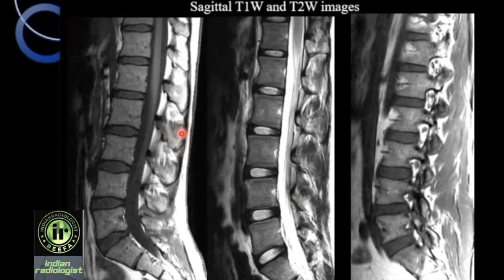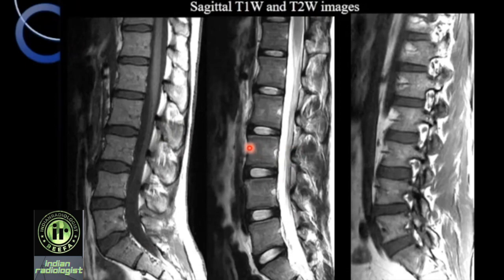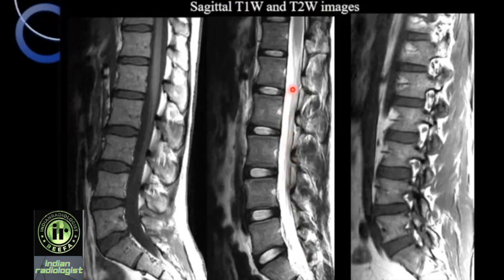When you measure the spinal canal, you have to measure it from the posterior cortical margin of the vertebral body, make it parallel to the orientation of the vertebral body, and draw it to the anterior-most margin of the spinous process. Normal dimension in the cervical spine is between 9 and 11 mm. In the lumbar spine, the lower cutoff is 12 mm; 10 to 12 is borderline canal stenosis, and less than 10 is definite spinal canal stenosis. This dark posterior line is the dura or the posterior margin of the thecal sac. These linear gray structures within the CSF of the thecal sac are the cauda equina nerve roots.